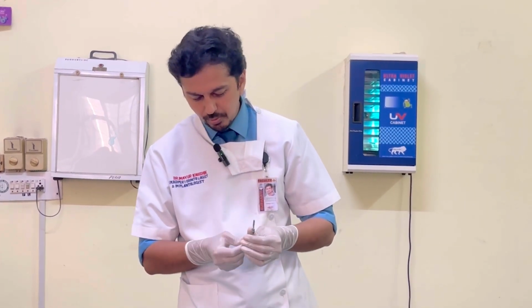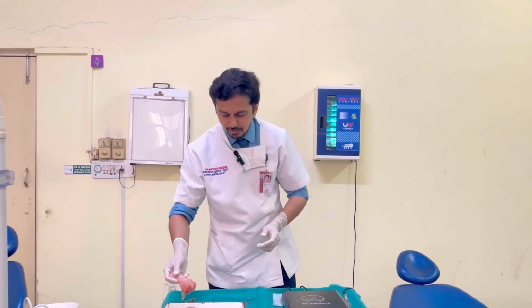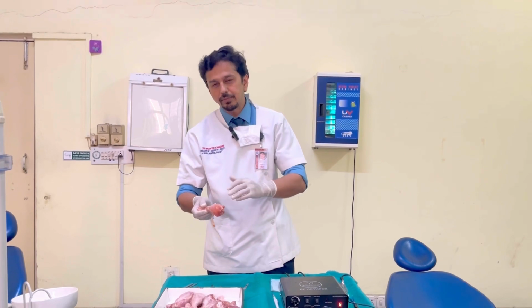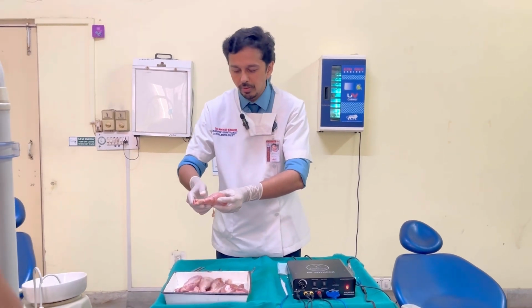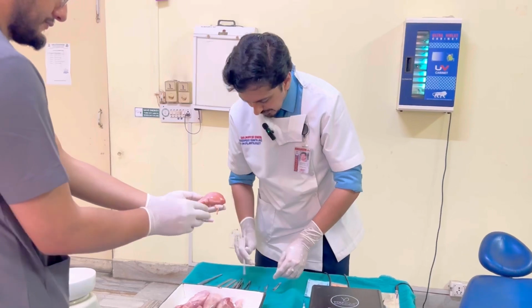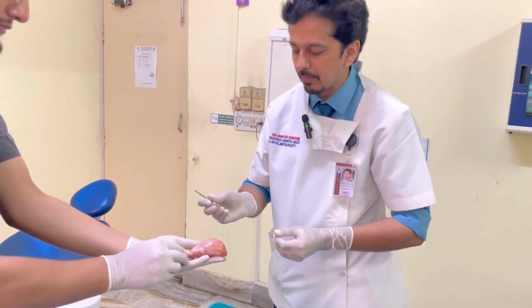So with regard to the demonstration, an animal model otherwise is preferable. Why is an animal model preferable? That is because you get to know the feel of the tissues in the case of an animal model. So let us start with the demonstration on an animal model with regard to a BP handle. In this round BP handle, I am attaching a number 15 blade.